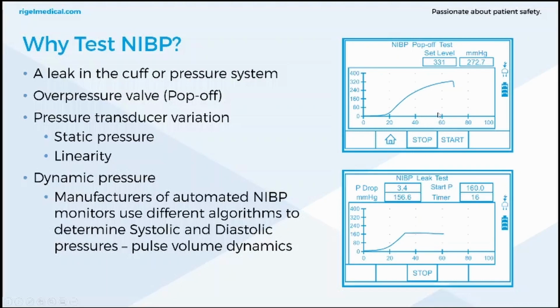And the pop-off test is produced by the patient simulator, where a value is increased until the vent within the patient monitor allows the pressure. So it's a safety measure. So the overpressure valve, we're also known as the pop-off valve.